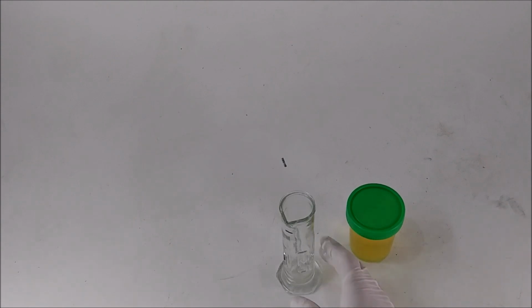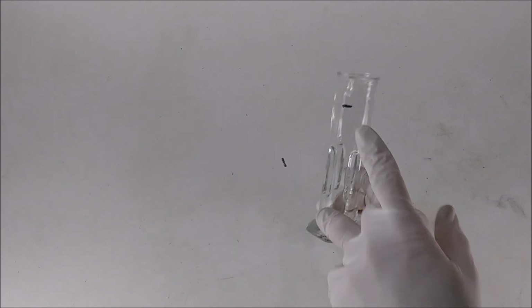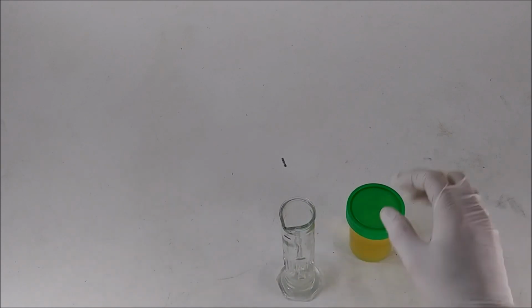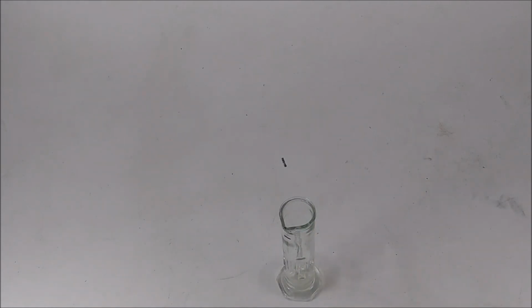So now we're going to fill our sample in the cylinder up to about that line. We'll need enough in the cylinder for the float to be properly suspended.